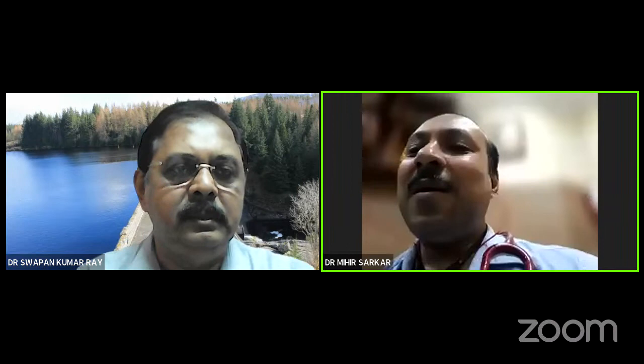Mihir, I have crossed just 6 minutes, but 4 minutes have been left for the question answer. Yes, thank you, Sapunda. This was a mesmerizing presentation. You have covered, I think, every possible chest X-ray, and will describe all the normal findings, how to read it, the systematic way to look at that during the session.